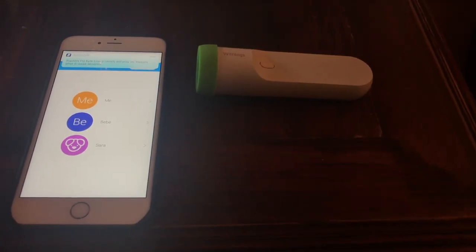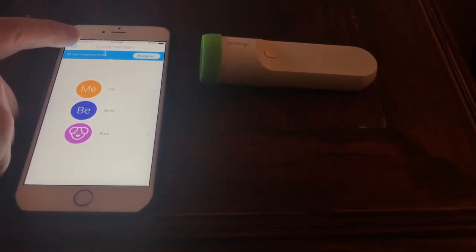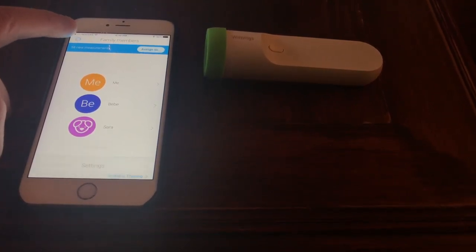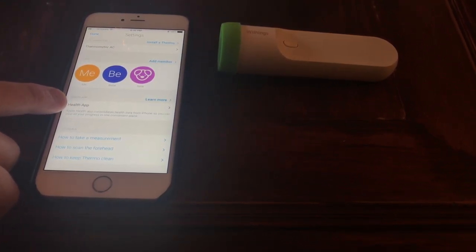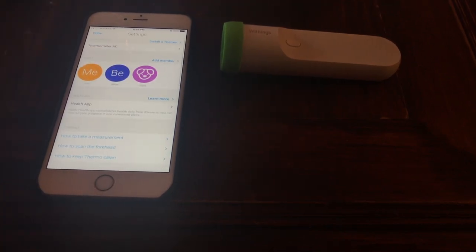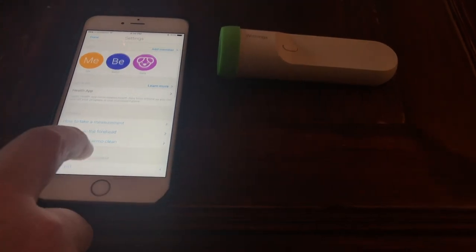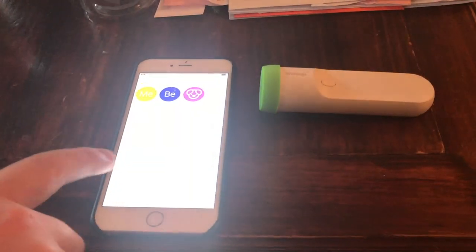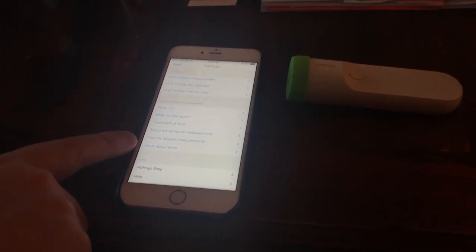So just a quick look at the app. Here I am in the Thermo app — it allows you to firstly edit each user. You can also go into settings and do a few things. For example, you can choose if you're connected to the Health app, which allows you to sync with your other health information, which is pretty important. It allows you to get some useful information, tells you all about how to scan, how to clean the thermometer, how to use it, and tells you a little bit about fevers.